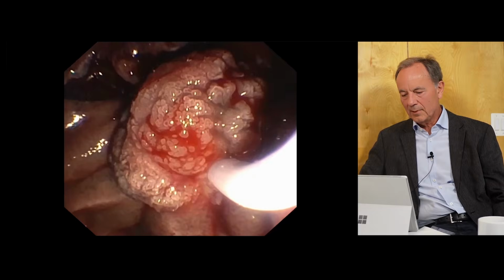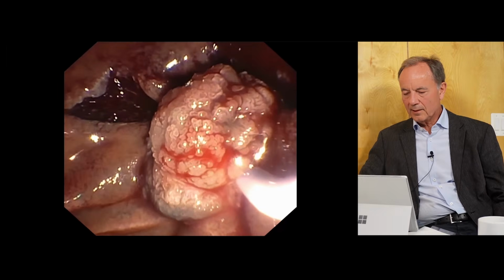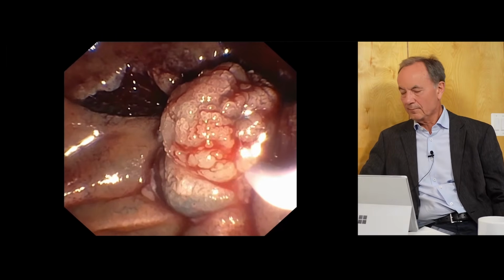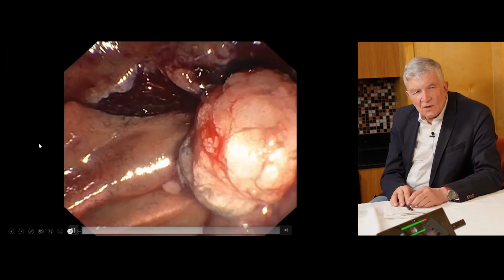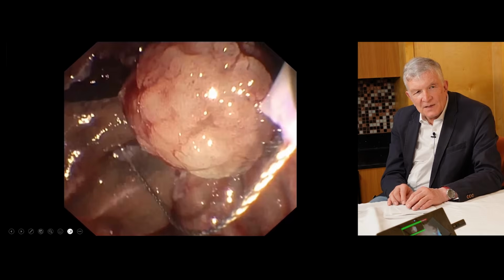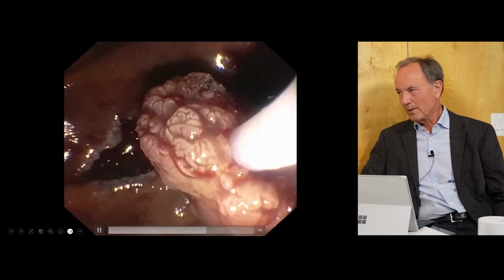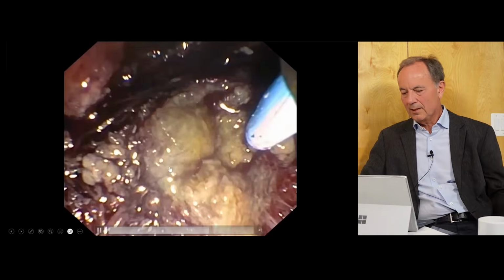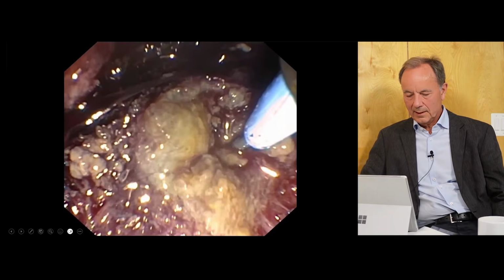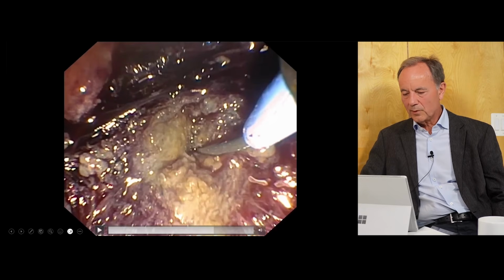We can remove it into the stomach to save some time. But you should do it piece by piece, not just resect, and then collect the remaining specimens. Although in such a case you don't need all the specimen, because there will be no cancer here. So now we achieved complete resection, as we can see, and I go back to show it again.